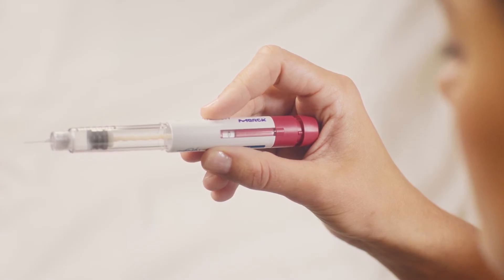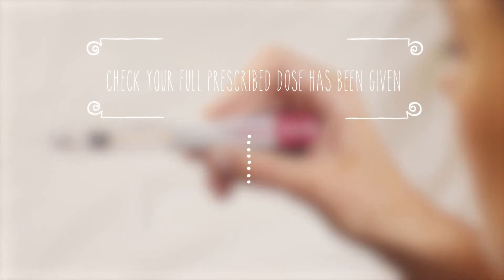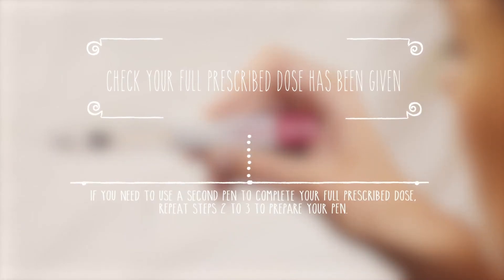Sometimes the display may show a number higher than zero. This means the pen has run out of solution and the full prescribed dose hasn't been given. The number shown is the missing amount that you'll then have to inject using a new pre-filled pen. If that happens, prepare a new pen like I've just shown you and set the dose to the exact number displayed on the dose window of the empty pen, and then do a new injection.